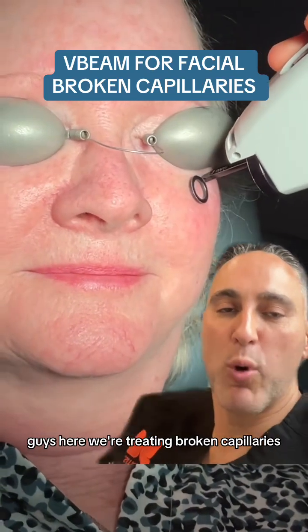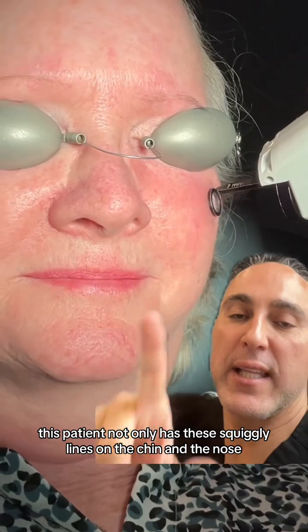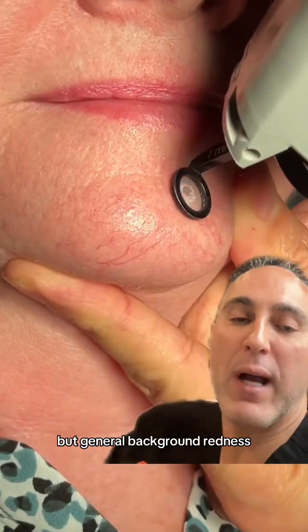Guys, here we're treating broken capillaries or telangiectasias on the face. As you can see, this patient not only has these squiggly lines on the chin and the nose, but general background redness.